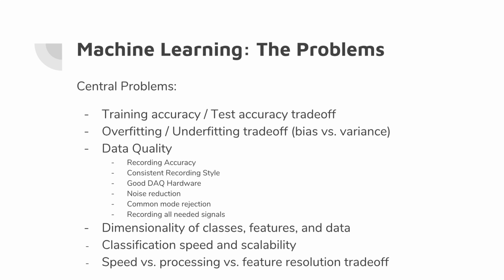And another note is the length of time you record a signal also affects this because it increases, first of all, the dimensionality of the data that goes into your algorithm, but also the length of time you record affects how high resolution you can get on your frequency transforms. And we'll talk a little bit about that.